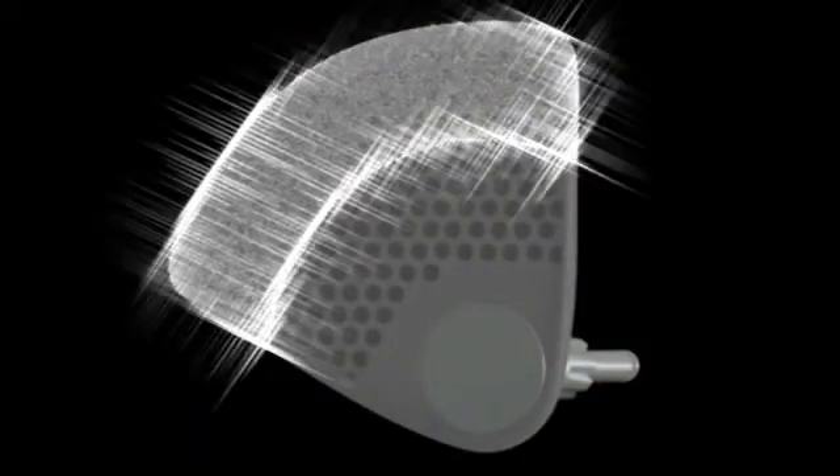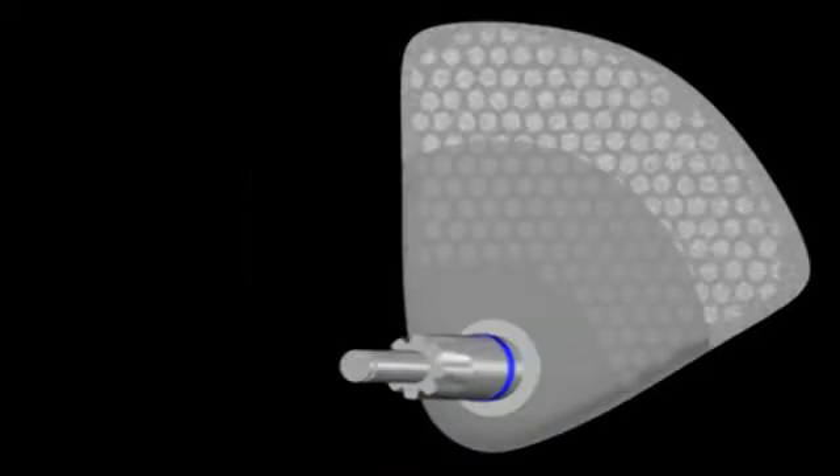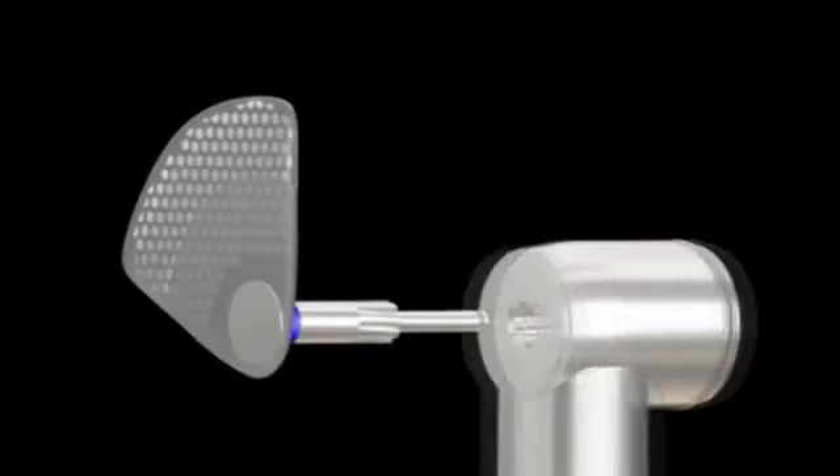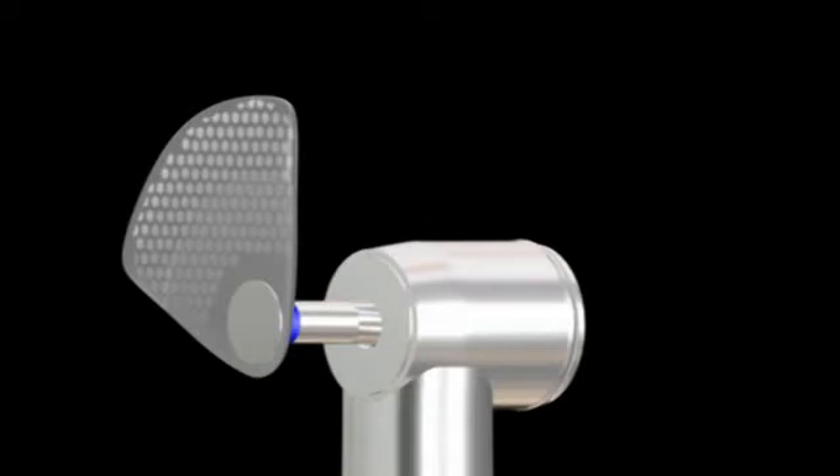Diamond discs are available in single or double-sided, with a range of different thicknesses and grits. Using the OS system will result in minimal reduction to tooth structure.